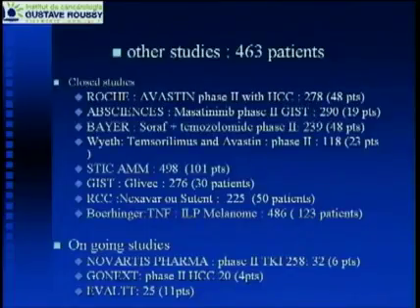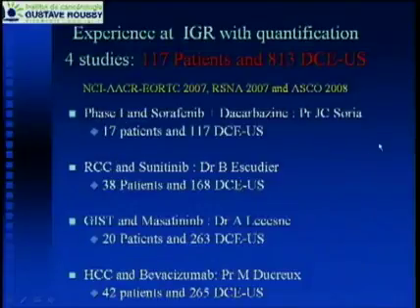And we also developed this methodology in phase 2, phase 3, and also in routine. For example, in hepatocellular carcinoma, in GIST, or in melanoma, and in colon cancer, in breast cancer. So concerning the level of validation, we decided to evaluate 4 different drugs in 4 different tumors in order to understand if we have the same parameters and the same timing.